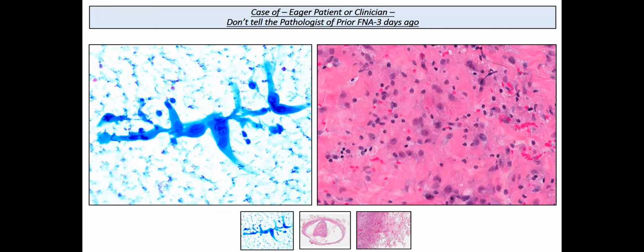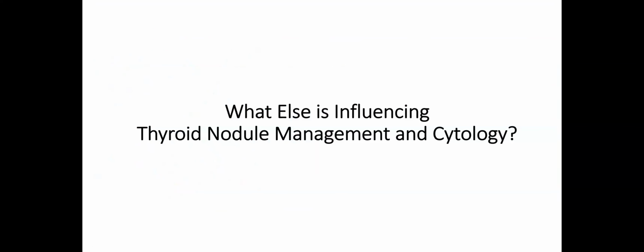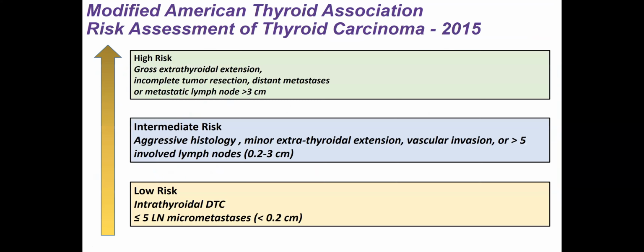marked nuclear pleomorphism. So what else is influencing thyroid nodule management and our cytologic diagnosis? The thyroid cancers are being managed based upon risk of structural recurrence.